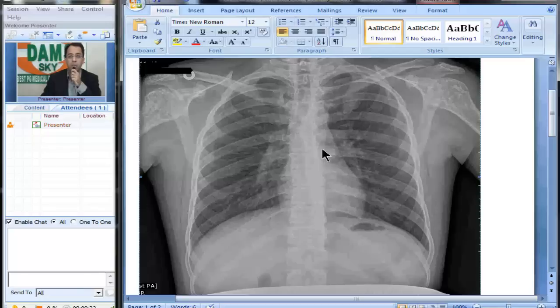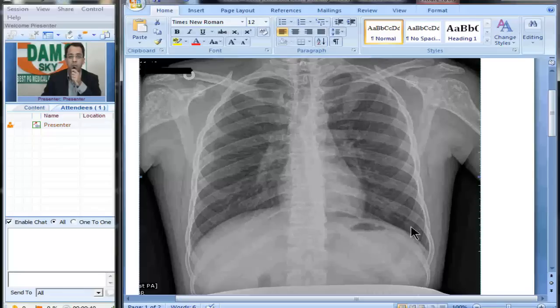Aorta is normal. Then we see the cardiac mediastinal borders — they look normal, cardiac size looks normal, diaphragm normal, symmetrical on both sides, CP angles are free. Both sides, chest walls look normal.